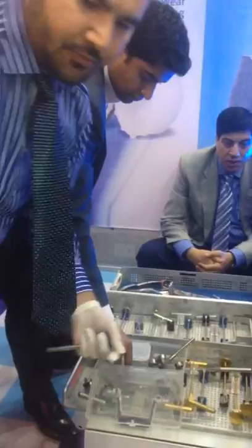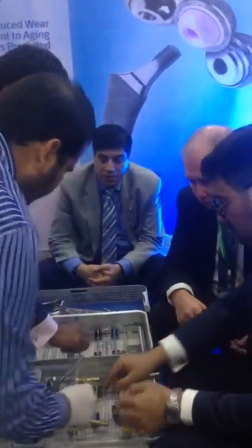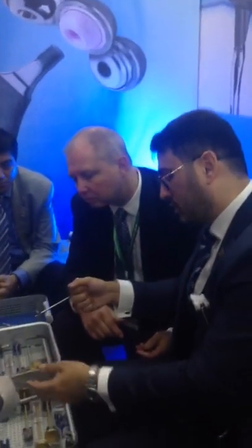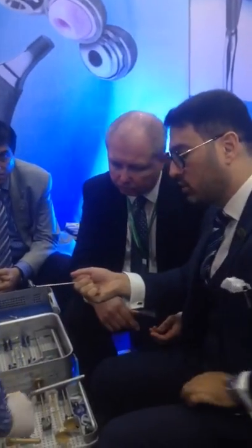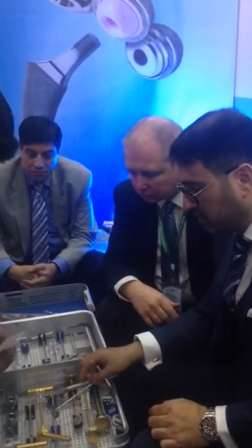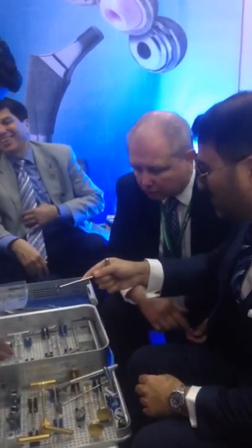So 40, 46, and 42 — it shows the jig that goes inside the glenoids. You have the center hole, and then you have the field. This is not central; these are all two pegs here. So that's the central and these are two pegs. We know our stuff — we've been well trained by Andrew.